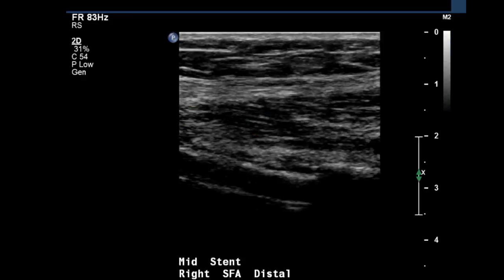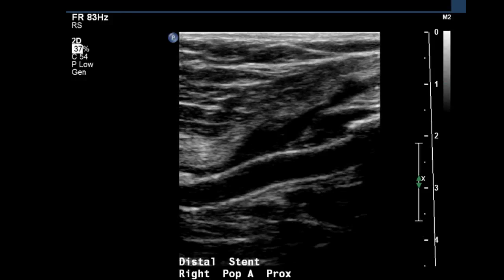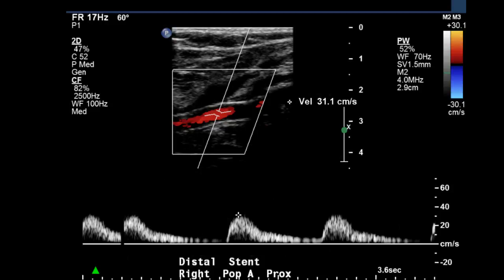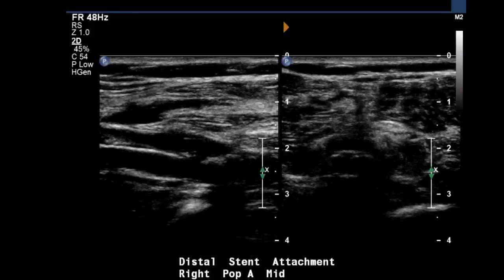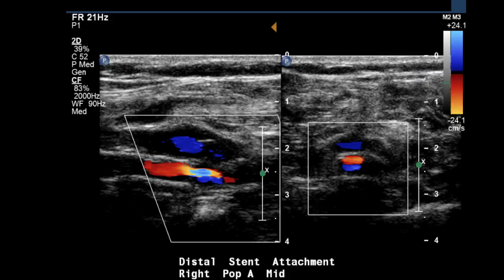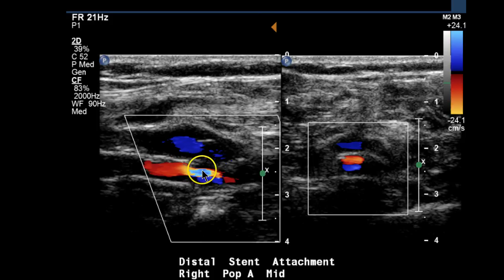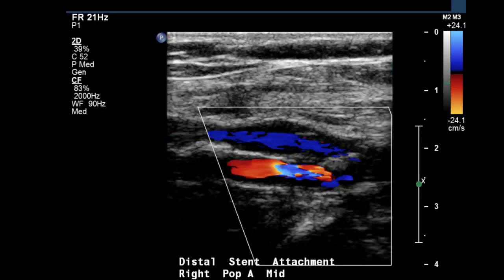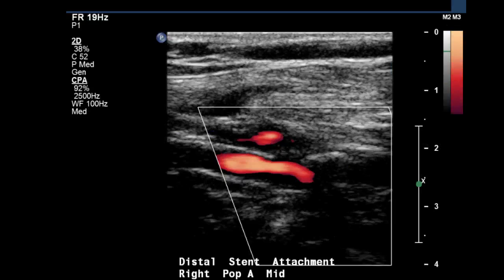As we continue to move through the stent, we'll see no further areas of significant stenosis until we get to the distal stent attachment. And again, you have laminar flow here, and then an increase in velocity of blood cells, showing aliasing indicating an increase in velocity — turbulence and narrowing shown with power Doppler.